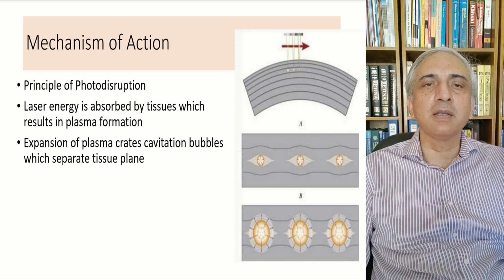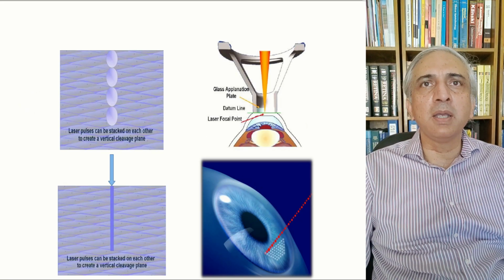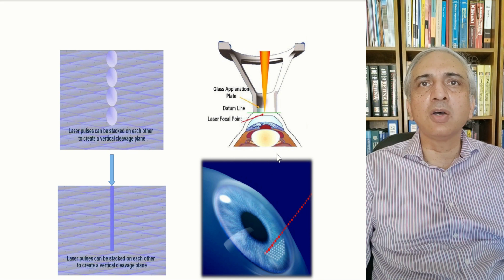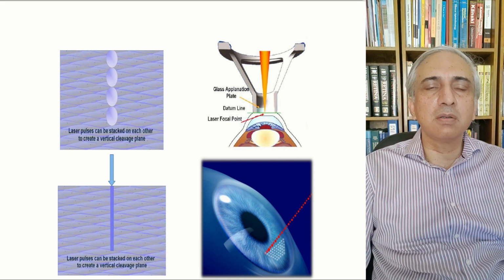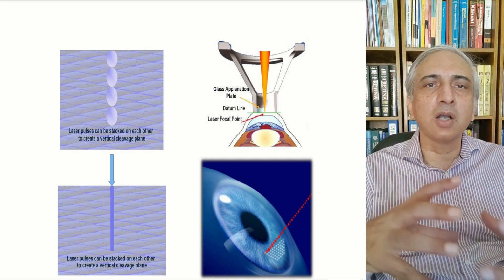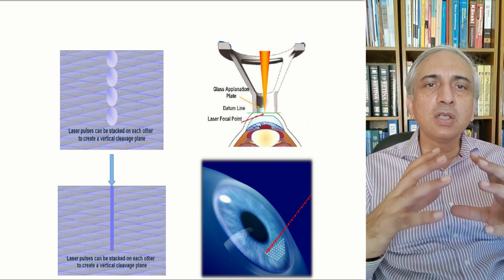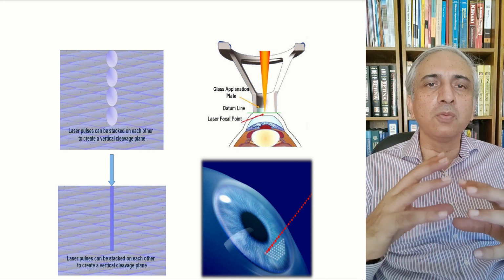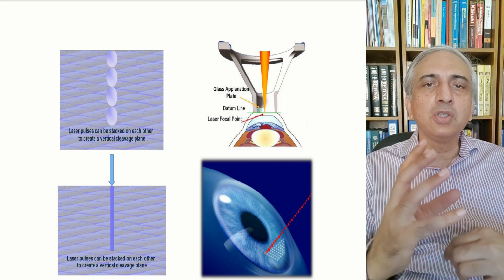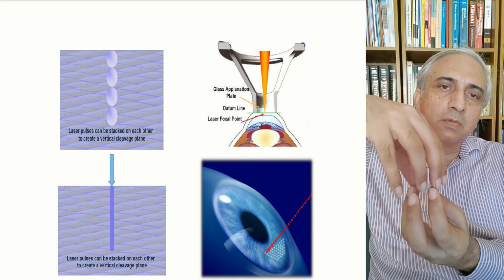patients when they're having femto cataract surgery. Here you can see the important thing which you need to remember is that the femtosecond laser always requires a docking. It cannot be applied without a contact lens. So it's different from an excimer laser. In order to produce a reliable contact with the cornea, you need to have a contact lens, and that is a disposable contact lens which costs a fortune.